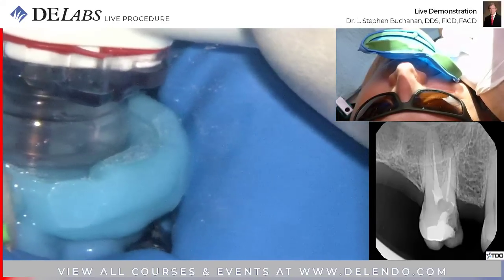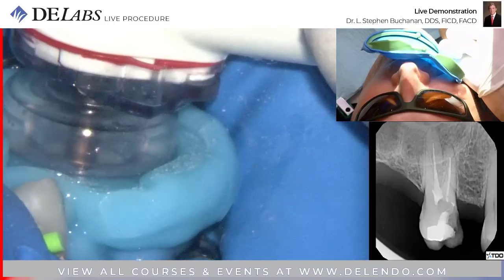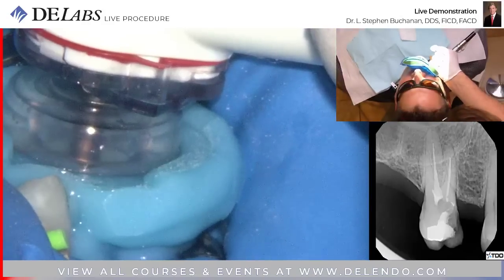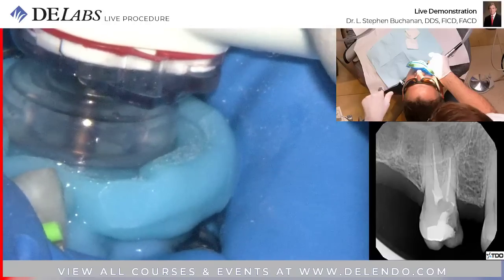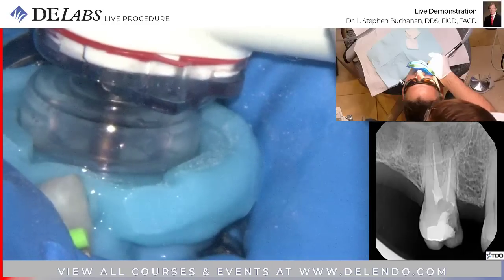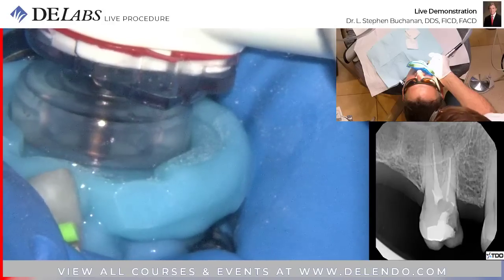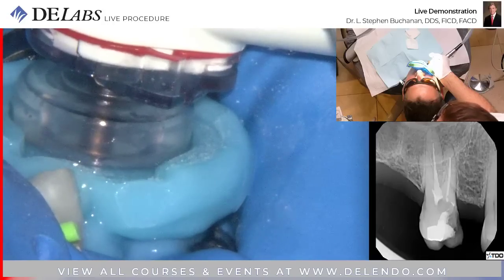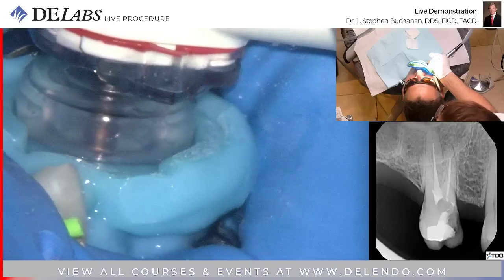Four and a half minutes, almost done with the hypochlorite cycle. I told them they need to have a little movie loop or something like Breaking Bad on a little monitor here so we cannot be bored for 8 minutes. Yeah, that's boring. I'm already bored. I'm going to make her life worse. I'm going to bore her now.